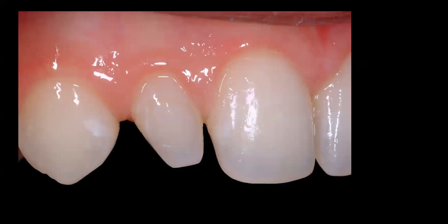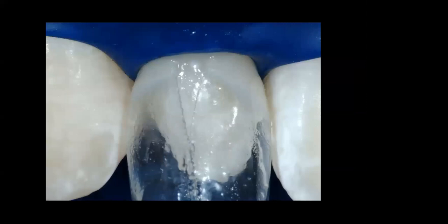And there it is. There's the acid etch. We've been able to reflect the soft tissue apically with a well punched rubber dam. I've already completed the central incisors. Here is the preoperative view from the lateral view. There is what we call the hip. We're going to take heated flowable composite and put a 1 to 2 millimeter hip in there. We'll hold the matrices and stabilize them. We'll light cure that, and then we'll do what's called delayed wedging, which we're going to show you in a minute. We'll put the diamond wedges in on the mesial and distal. That pushes the teeth apart, and then we'll injection mold the rest.